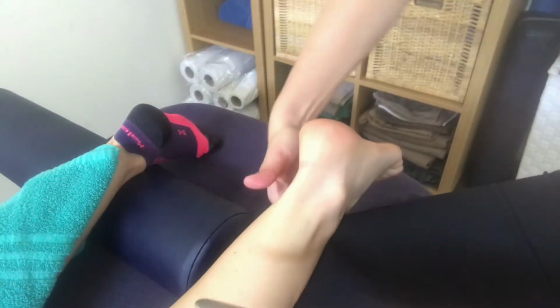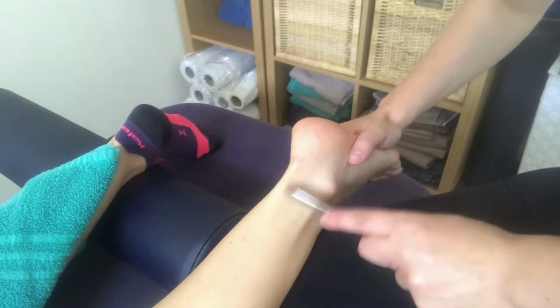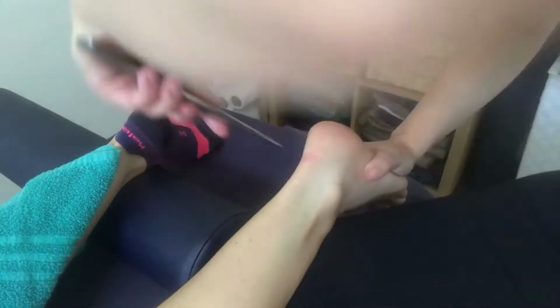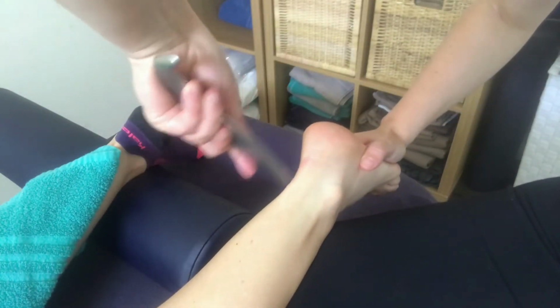And here is a more specific look at around the Achilles tendon. So we can work in the medial or the lateral side of the Achilles tendon. And again, same thing with the soft tissue release, passive or active. And then using your knee as a supporting lever, a supporting base for the ankle.